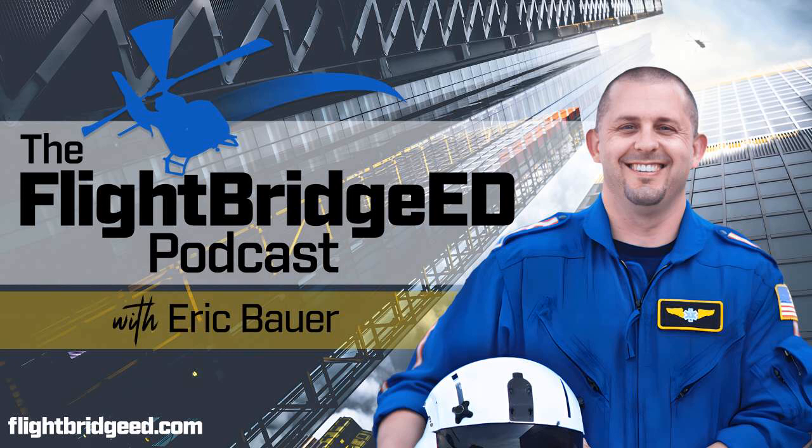High tidal volumes of 10, 12 mils per kilogram have shown very poor outcomes for our patients. They did the studies where 6 cc's per kilogram for your tidal volume really reduced morbidity and mortality. So with this injury approach, we want very low starting points for our tidal volume, and that's where we get tidal volume equals protection.